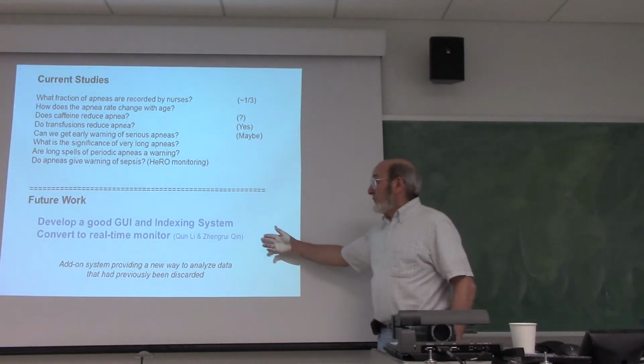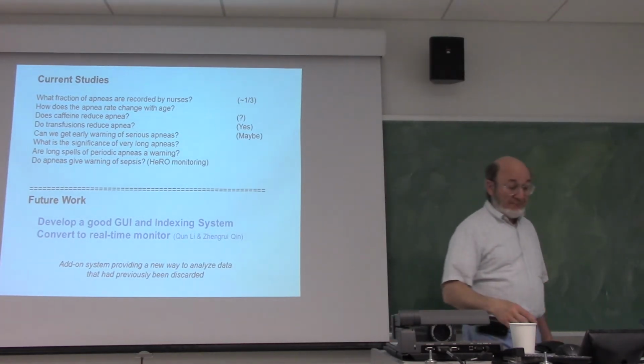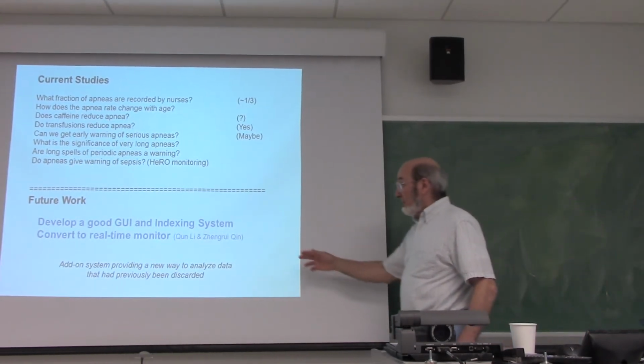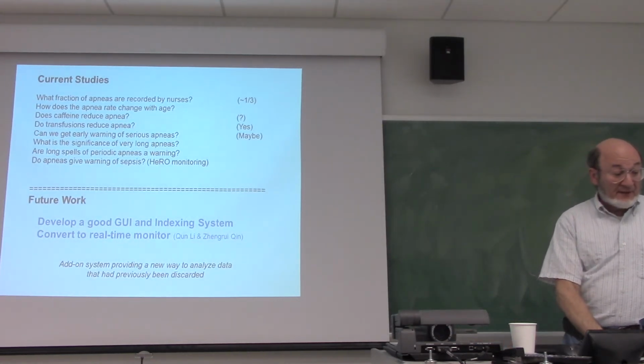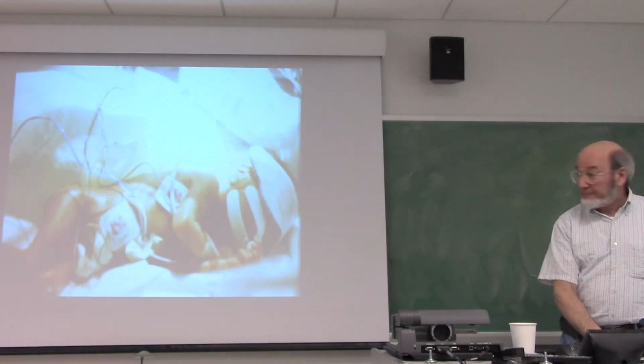Eventually, we hope to convert to a real-time monitor. The apnea monitor that we have works retrospectively. And we hope that we can convert it to a real-time monitor that can then be implemented in the NICU. Anyways, an add-on system that provides a new way of analyzing data that had previously been discarded.